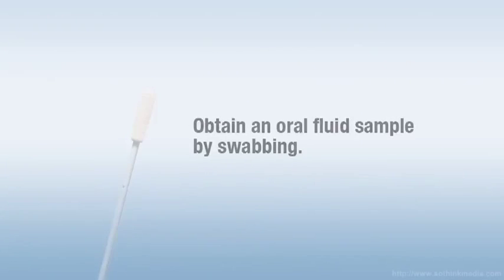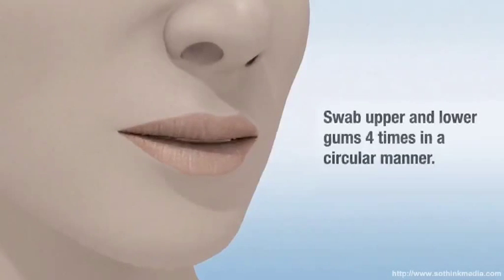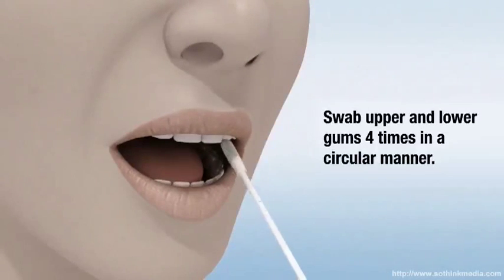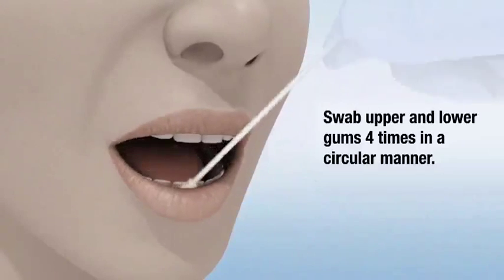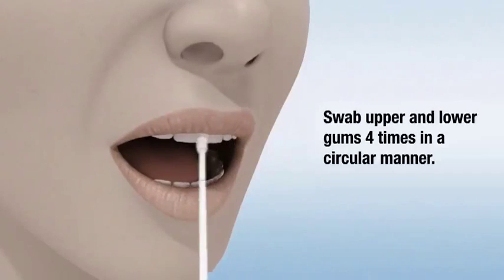Obtain an oral fluid specimen by gently swabbing between the upper and lower lips and the cheek and gums. Swab four times in a circular manner for a total of 15 to 30 seconds.